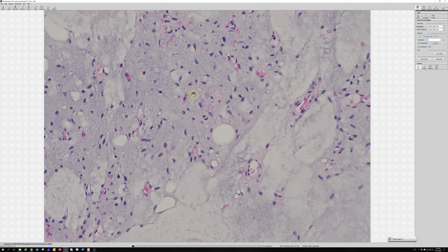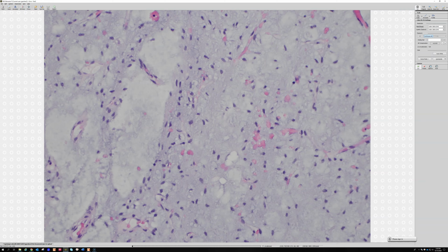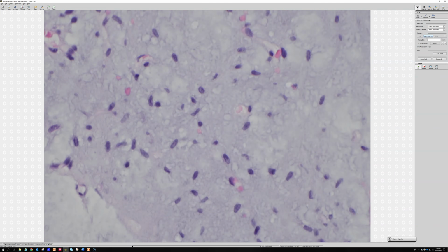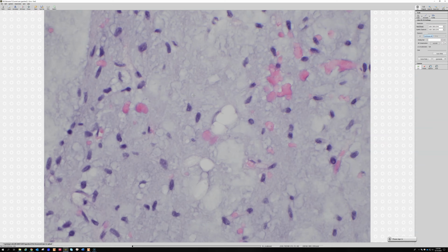See, he's like a little tiny signet ring. That's actually a tiny little baby adipocyte right there. Sometimes you'll get ones like this that are multivacuolated, but still a very bland nucleus. They can sometimes have two or three little vacuoles, but the nucleus is very bland and doesn't look atypical.